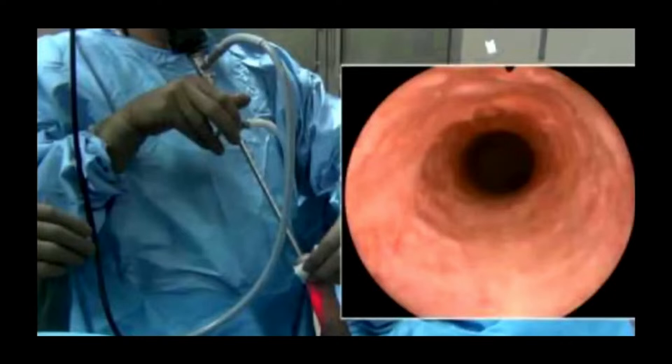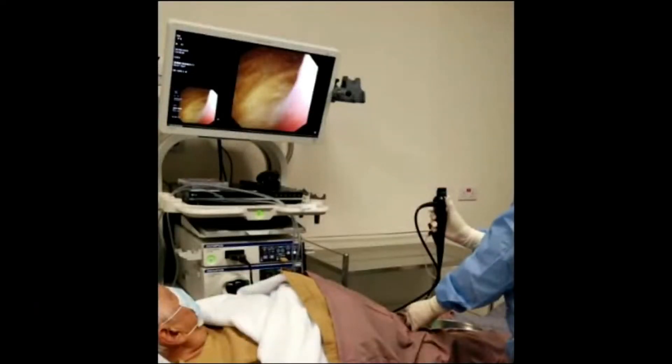Here's an example of a doctor using a rigid scope. You have to stretch out the curves — we'll go into more detail about how men are built on the inside, which makes the rigid a little more difficult. This is what it looks like when you're looking down through that scope — that's the urethral channel looking right in, and you can examine all the walls so you get a very good view.